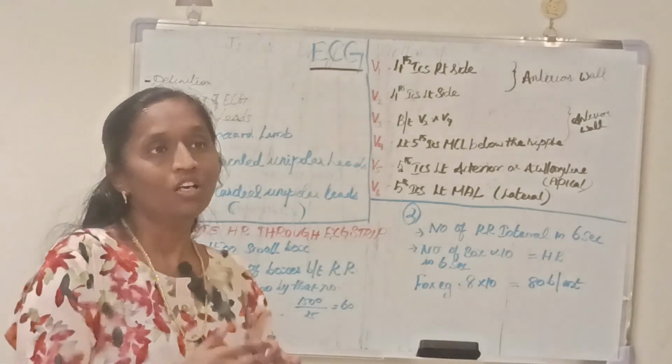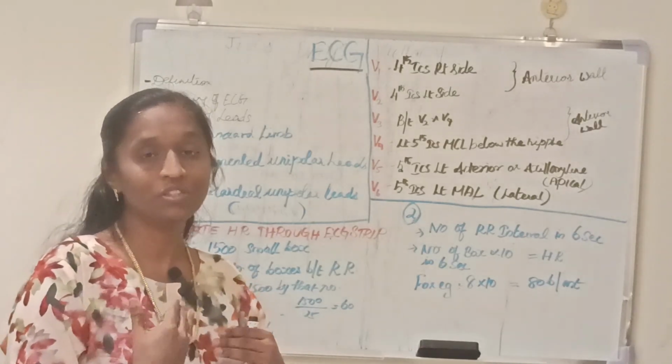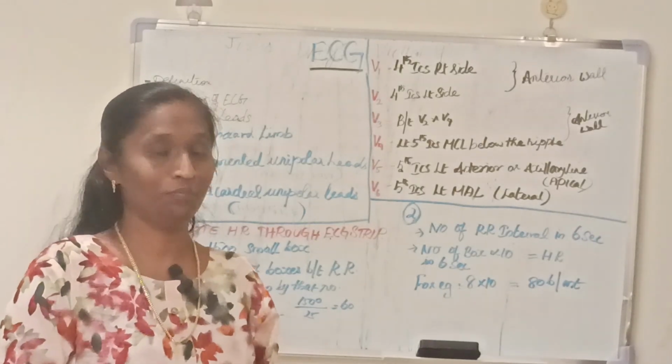Understand? So we can mainly see the conduction of the heart, and if there is any problem in that, we are able to identify it with the electrocardiography.